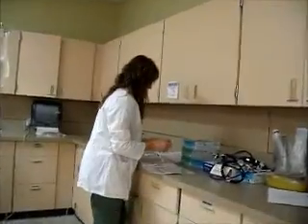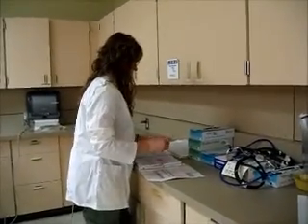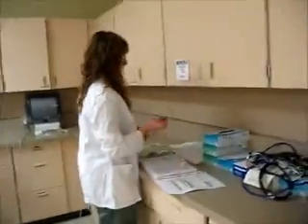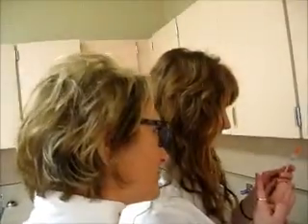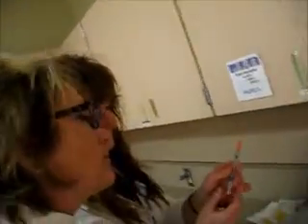Okay, so I'm going to inject 8 units of air into my vial, and I'm going to draw up 8 units. So I have 8 units in here, and I'm going to have another nurse check for me, and check the vial, as well as my other insulin.